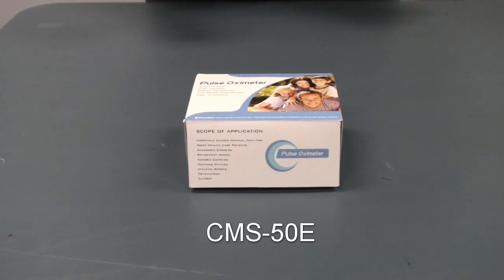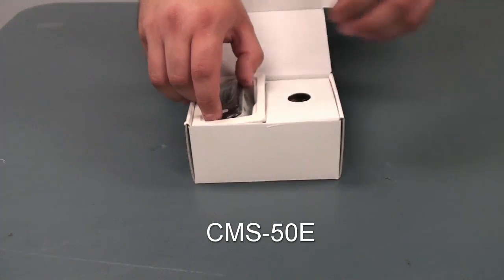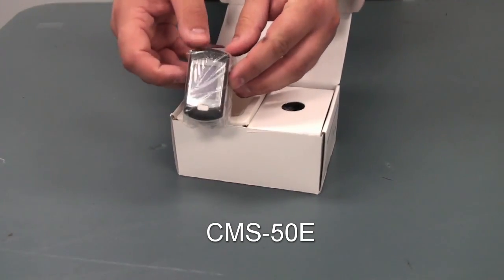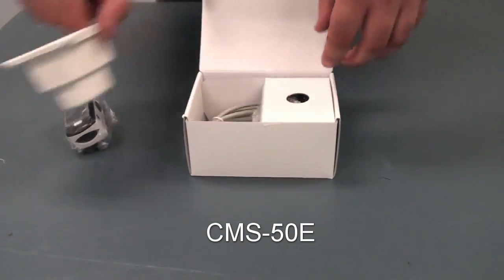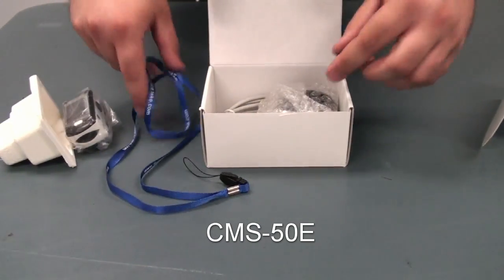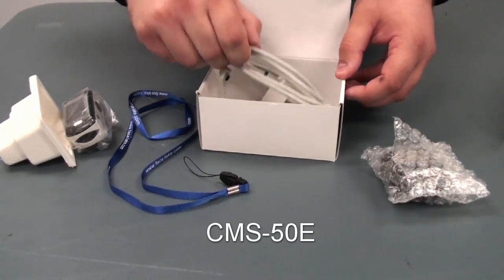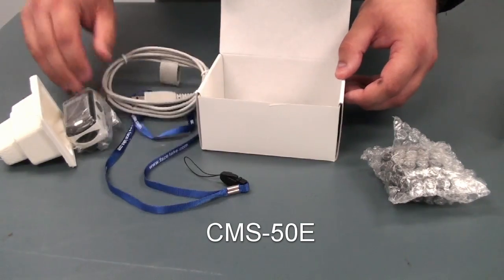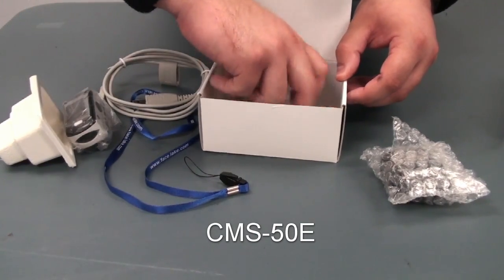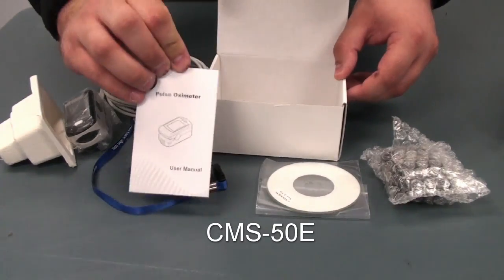Hello, and welcome to the unboxing and short tutorial for our CMS50E model. Inside the box, you will receive the device itself, a lanyard, a charger, a transfer cable, a software disk, and manual.